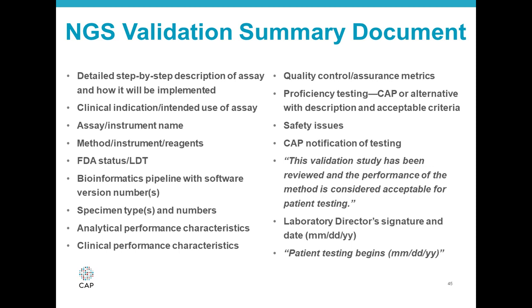And good practice also requires a statement like I've listed here. This validation study has been reviewed and the performance of the method is considered acceptable for patient testing. And there should be a section in the validation summary for the laboratory director's signature with date, and also the date that the actual patient testing began, which of course should be sometime either the day that the laboratory director signs it or sometime after that.